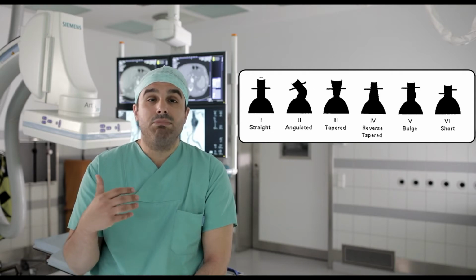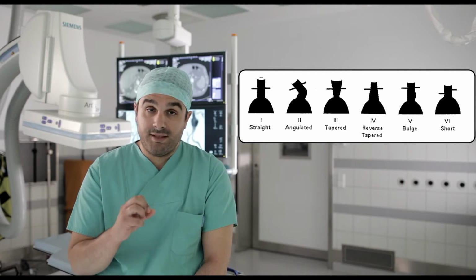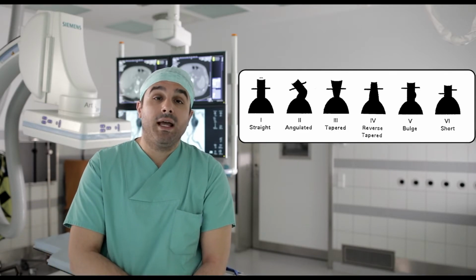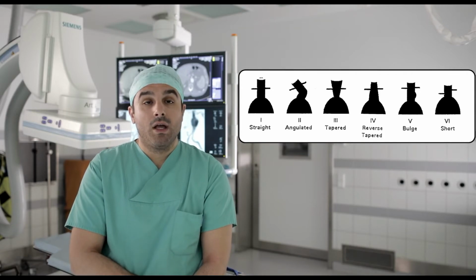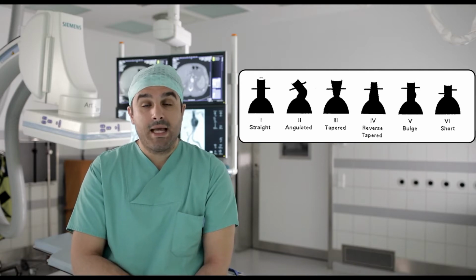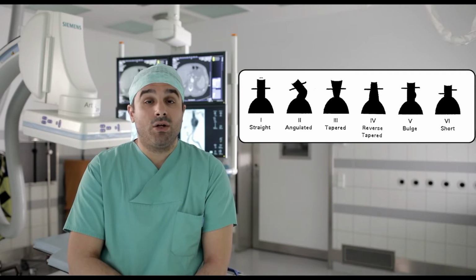Finally, there is the bulge neck, which will be carefully assessed if this could be a criterion to go for a fenestrated or chimney endografting, and the short neck. We have now a CE certification for EVAR for short necks, but this remains still controversial. However, it is not an issue of this tutorial.